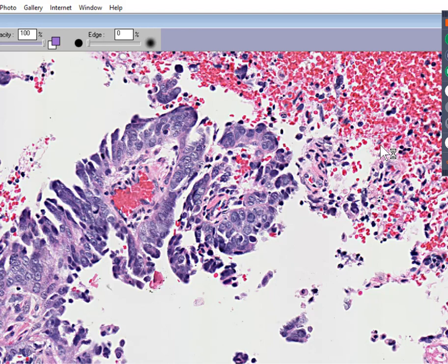What else can we say? We can say, well, it looks like the tumor cells are not mucinous, so this ovarian tumor is probably not going to be secreting mucin, but it may secrete a non-mucinous thing like a more watery or serous fluid.